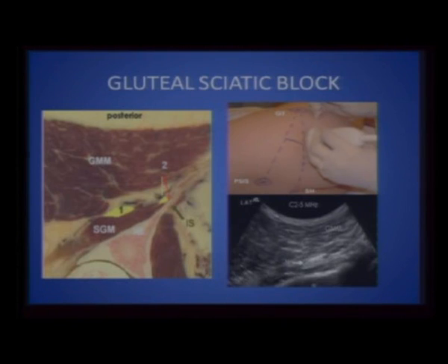The gluteal sciatic approach shows a huge bulk of the gluteus maximus muscle, with the sciatic nerve crushed beneath it in a lip-shaped structure, sitting on the superior gemellus muscle, with the ischial bone going medially as the ischial spine. One difficulty here is that there is no artery to guide you to the nerve, so initially you may not know whether you are imaging or imagining. Sciatic block at the gluteal level is definitely not for beginners, and when you attempt it, always use a peripheral nerve stimulator as well.